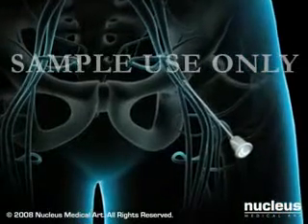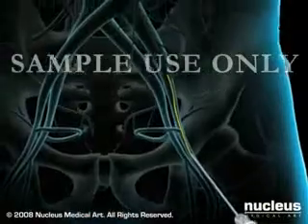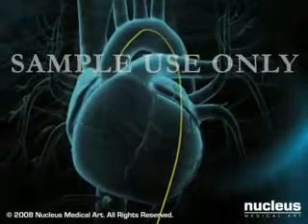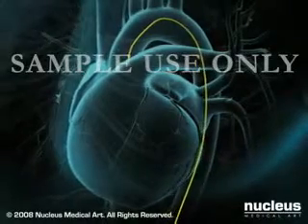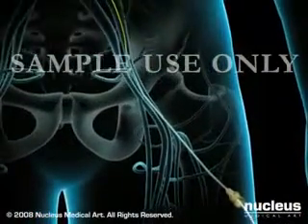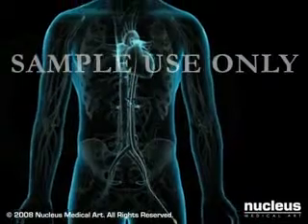The doctor numbs the skin in your groin area and inserts a needle into your femoral artery. Once the needle is placed, a wire is passed through the needle and gently guided through the arterial system to the heart. The needle will be withdrawn and exchanged for a small flexible tube called a sheath that permits access to your femoral artery. Next, a soft, flexible catheter will be slipped over the wire through the sheath and threaded up to your heart. Your physician will watch the movement of the catheter on the fluoroscope. You may feel pressure as the wire and sheath are inserted, but you will not feel their movement inside your arteries.